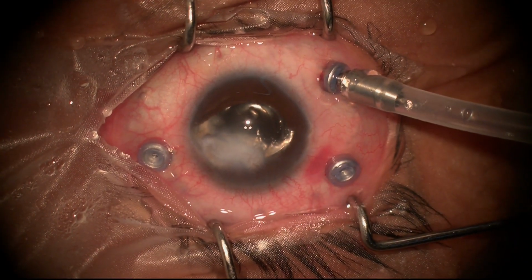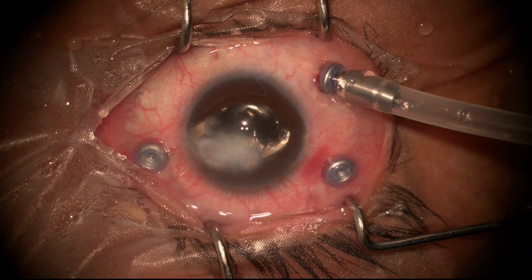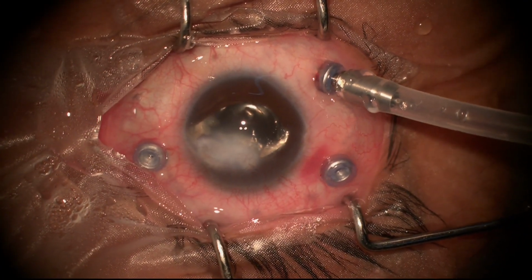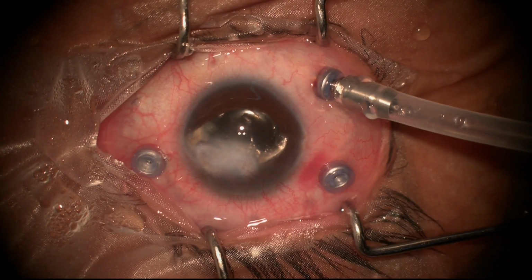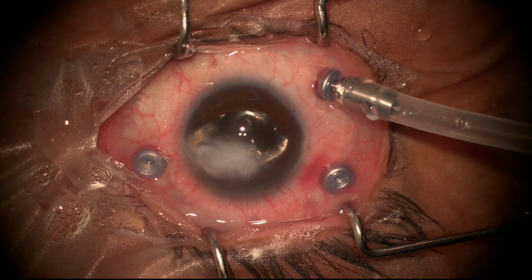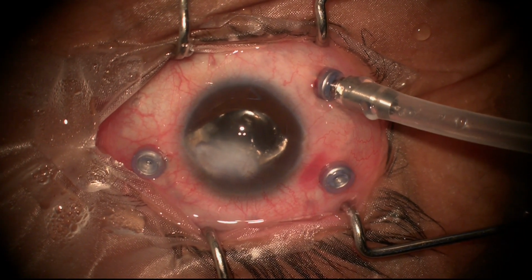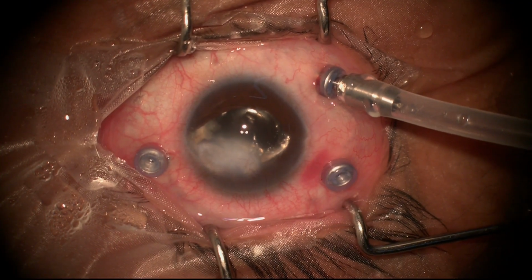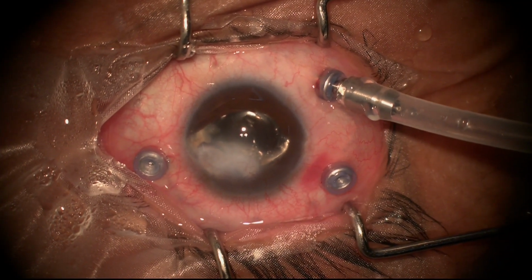Give me the MVR. Now there's a saying, perfection is the enemy of good. What does it mean? If we try to be perfect, we might... It's a very relevant situation right now. Yes. There is another saying: jaan bachi lakhon paaye, a life saved is a fortune gained. It says that you manage it, don't fiddle too much, because it's a very compromised situation.